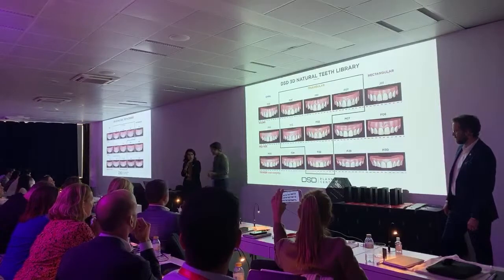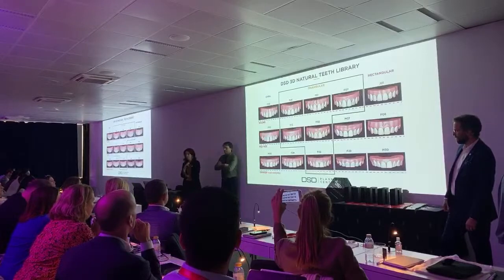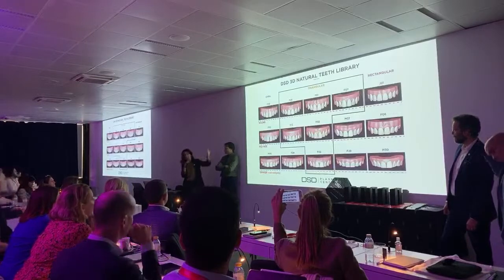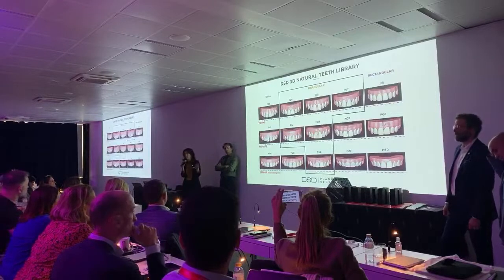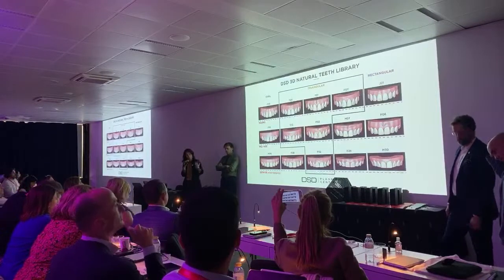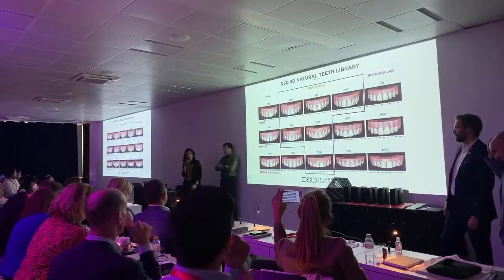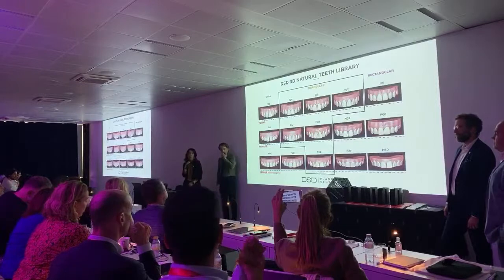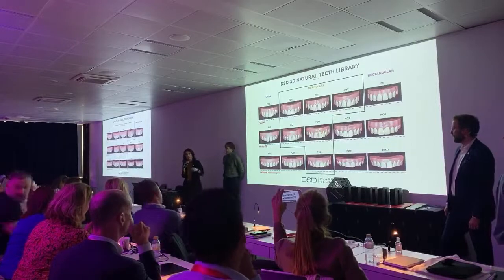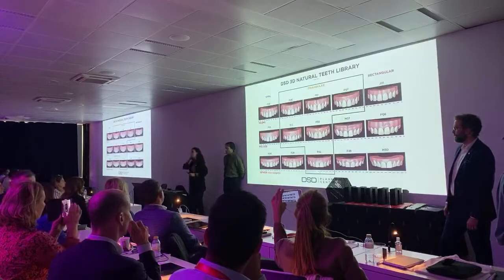This is under construction, and whenever we have this ready, we'll send it to you as a small menu, so whenever you order the case, you can choose in advance the teeth you want, the library you want. I think it's nice to share with the patient also, so we avoid modifications on the library. We want to stimulate you all every time you order.